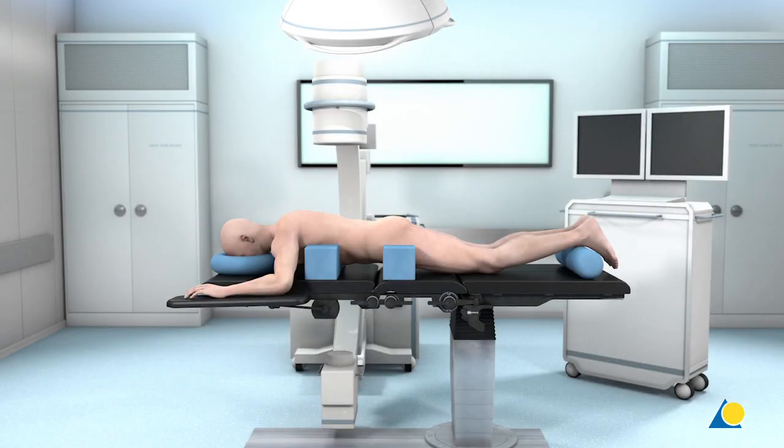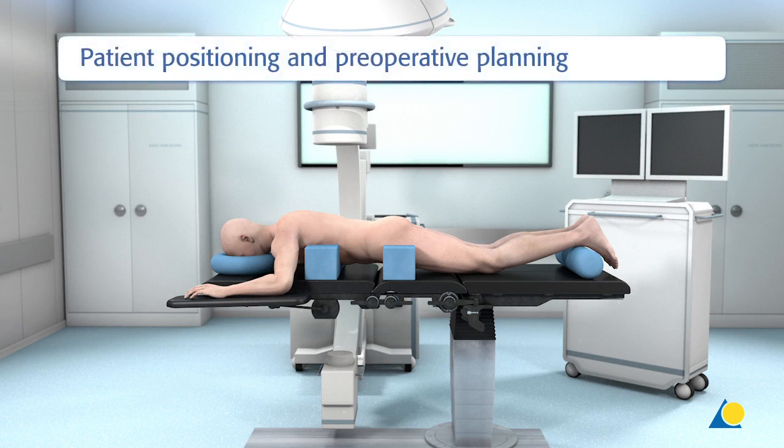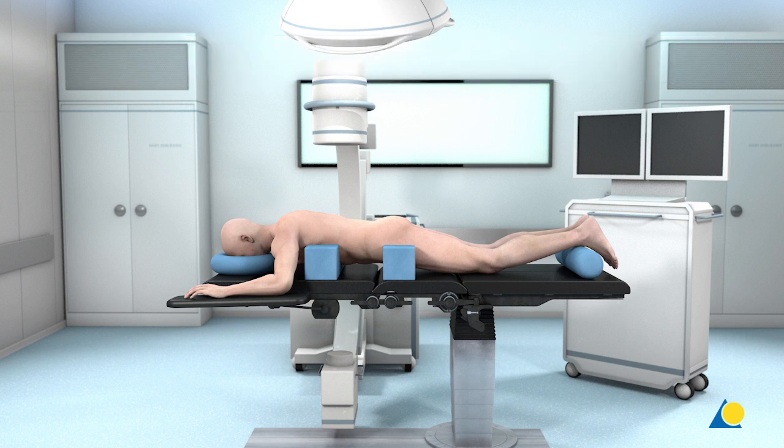In the practical exercise that follows, the previously described clinical situation will be simulated. The patient is positioned prone on a radiolucent table on two horizontally placed padded bolsters, one at the level of the sternum and another one at the level of the anterior iliac spine or a frame. To avoid increased intra-abdominal pressure and prevent excessive venous bleeding, the abdomen should hang free. Adequate padding needs to be provided to prevent pressure sores at the elbows and knees.